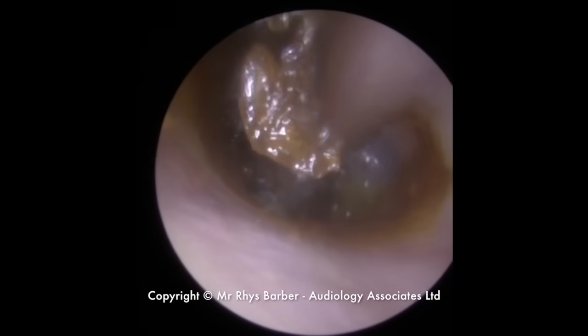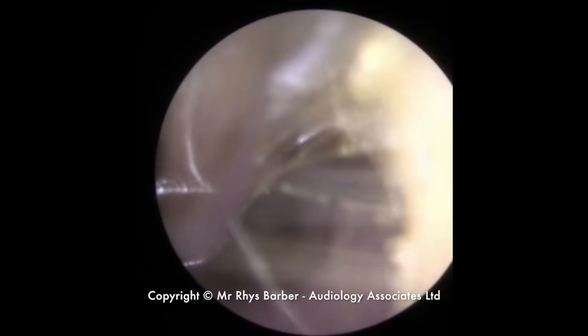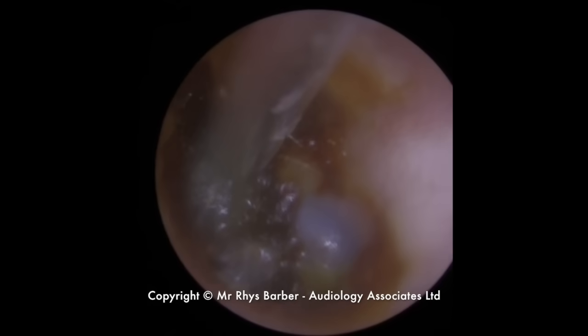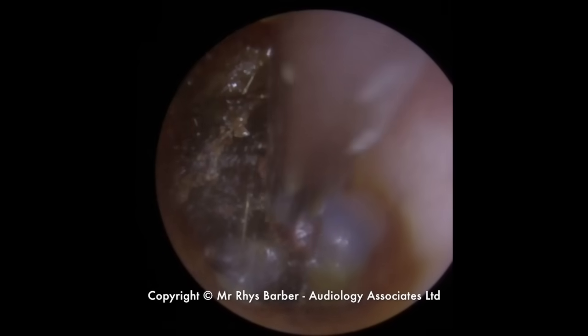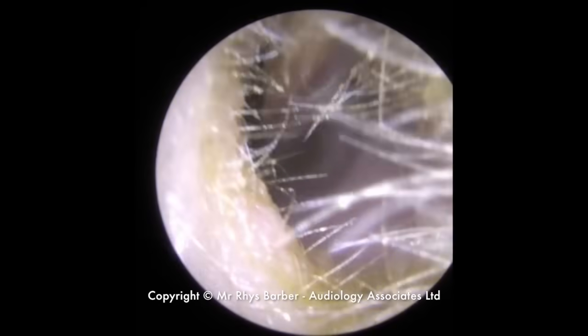Just taking another little piece away. The difficulty with using a fine end — normally with a larger piece like this, you'd use the standard zolomertube. But we just don't have enough room in this ear canal. It's so narrow and so small that we're having to use the fine end. It's just a case of breaking these little tiny pieces of wax away.